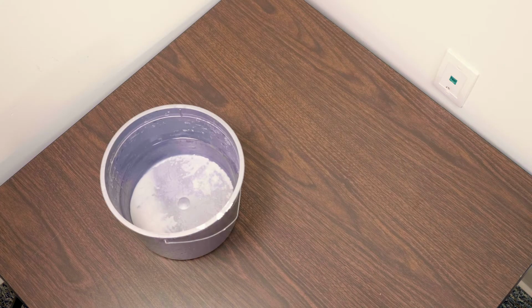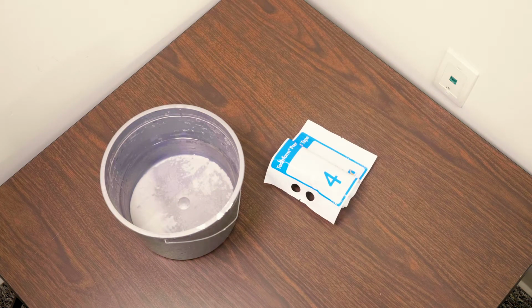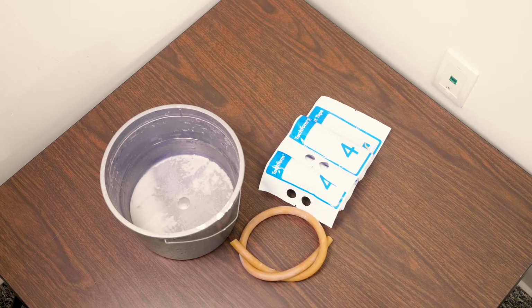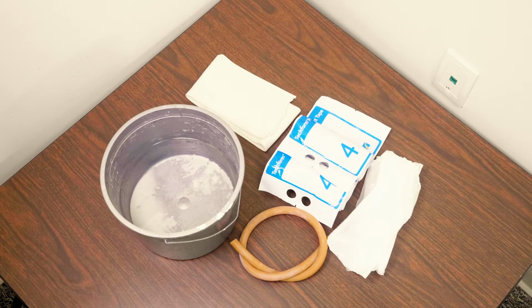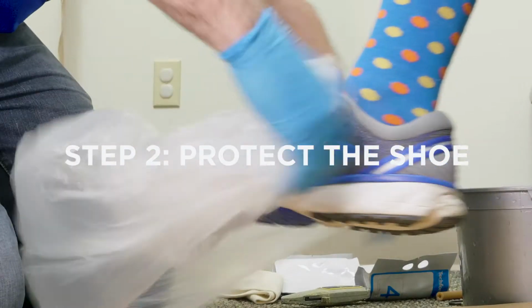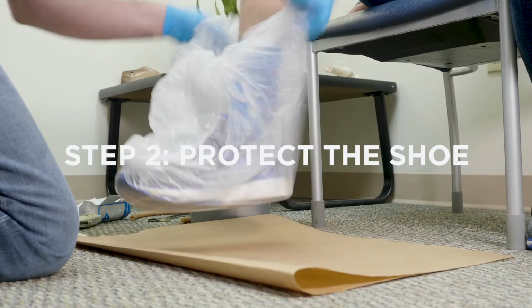You will need a bucket filled with warm water, fiberglass casting material, enough for 2 layers around the foot and ankle, surgical tubing, bias stockinette, a plastic bag, scissors, and something to cut the cast, like a cast knife or a cast saw. Now that we have all of our supplies, it's time to get started.